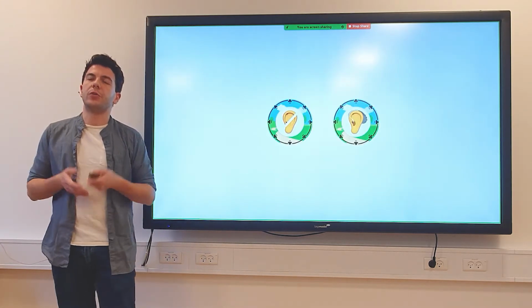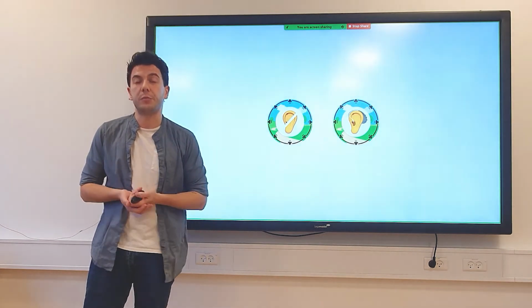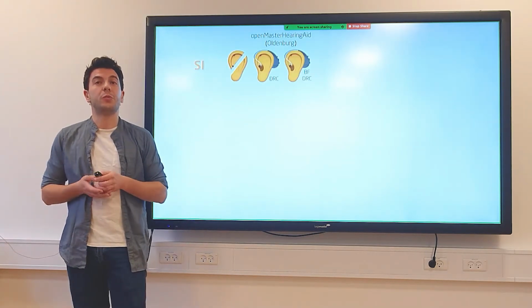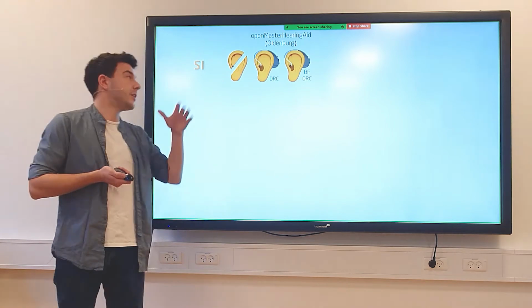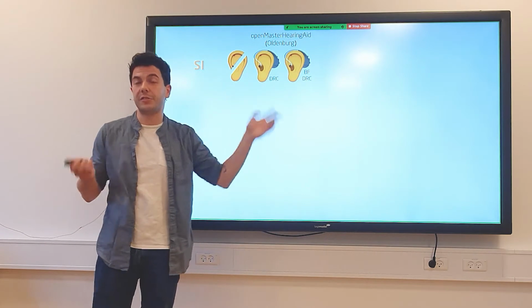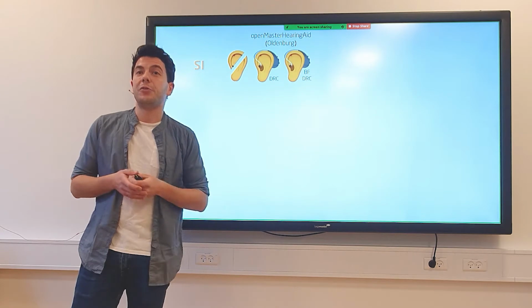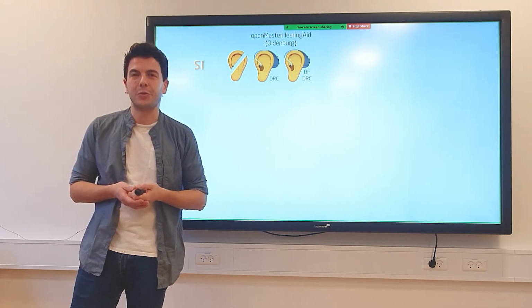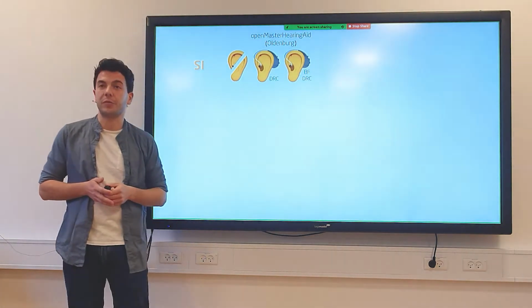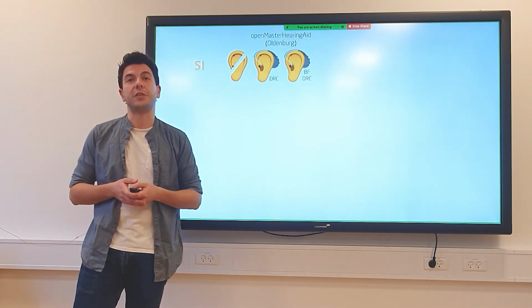Going beyond that though, we also wanted to look at how hearing aids, when used by hearing impaired people, could affect their speech intelligibility performance. And that was the second experiment, in which we evaluated speech intelligibility, again for hearing impaired people, either unaided or helped by 2 different hearing aid strategies, which were implemented on a real-time hearing aid simulator that we built using the Open Master Hearing Aid framework developed at Oldenburg University. And there were 2 distinct strategies here, one that only included dynamic range compression, and a second that included beamforming on top of dynamic range compression as well.